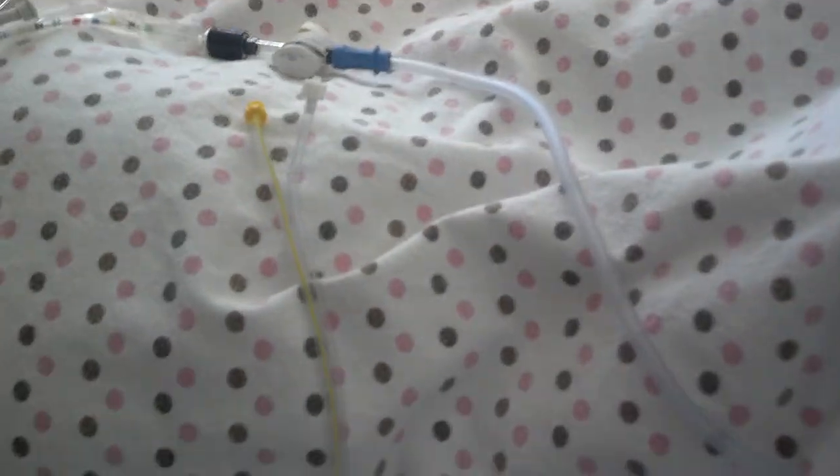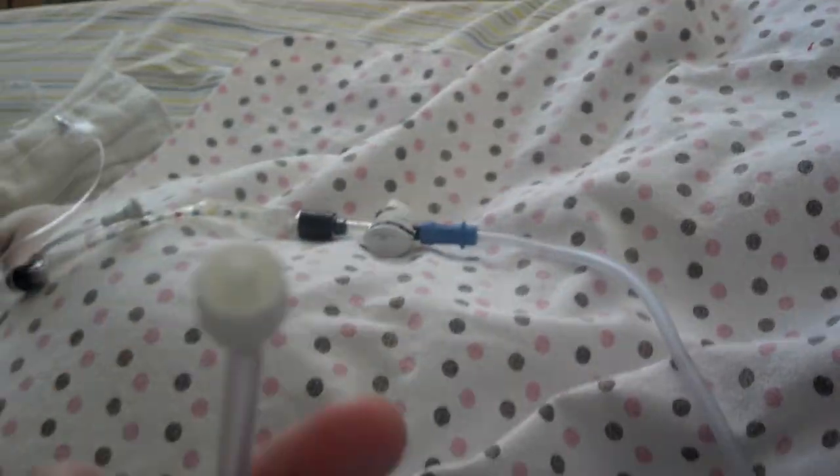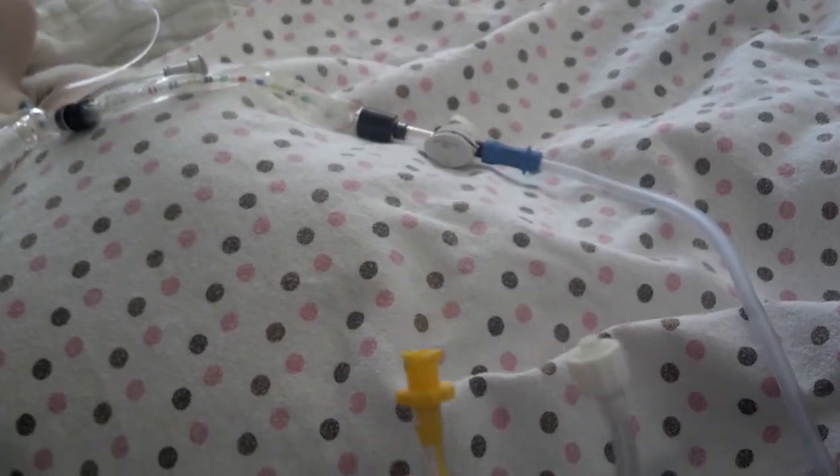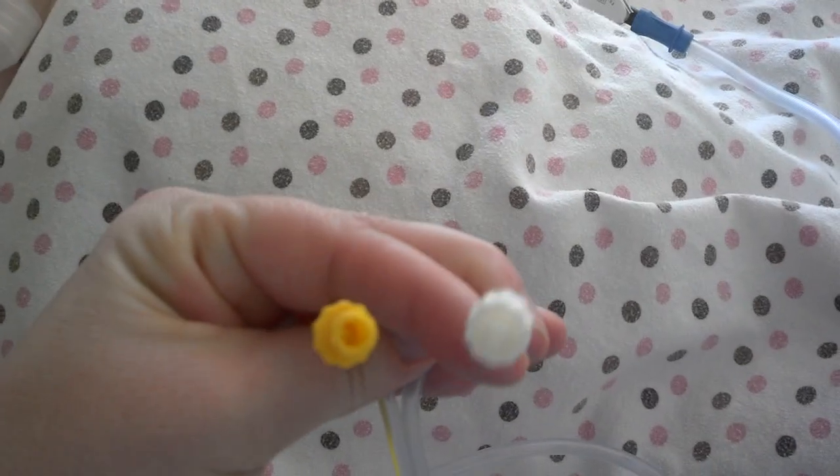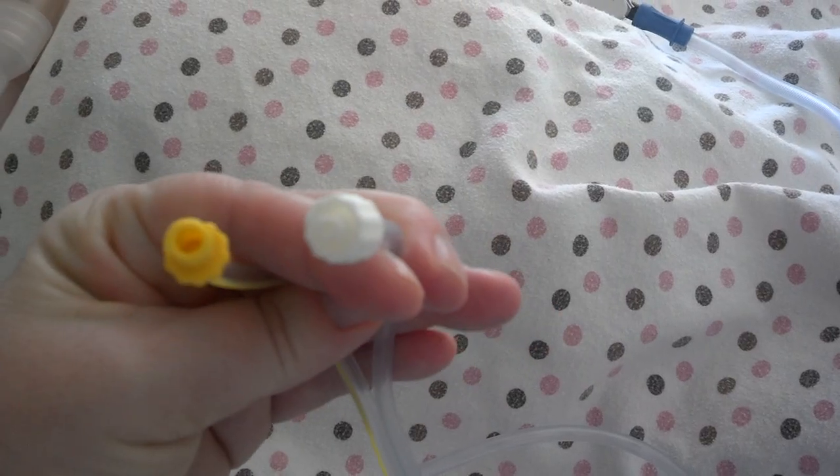Just to show this a little more closely — this has another one too, a clear one that just slips on. You can see the ends of them. They're a little bit different, so they fit differently on the circuit.